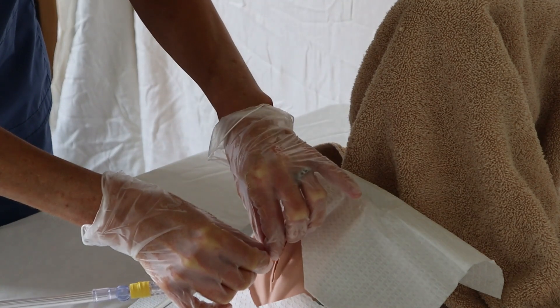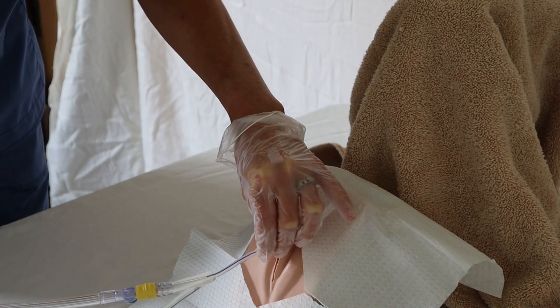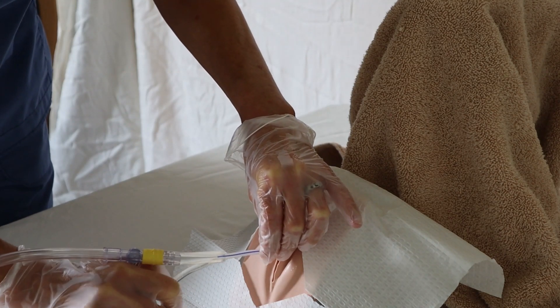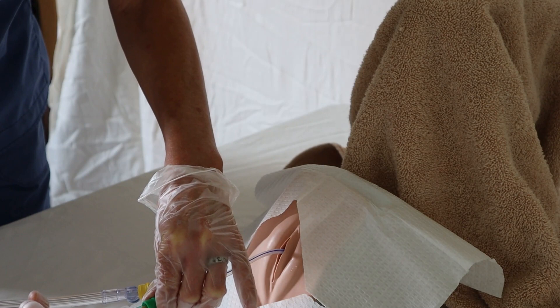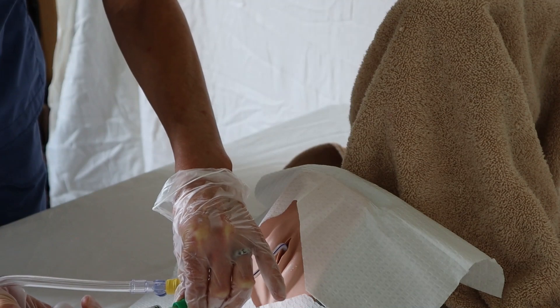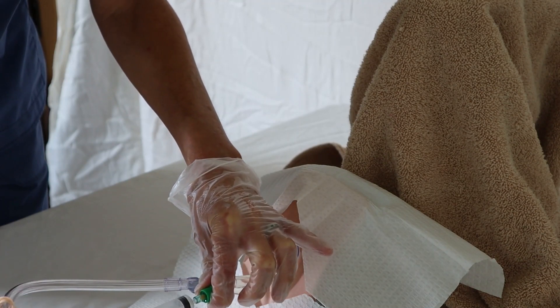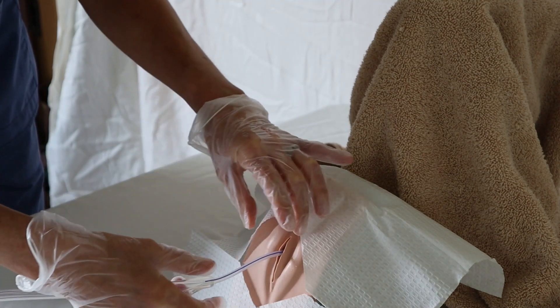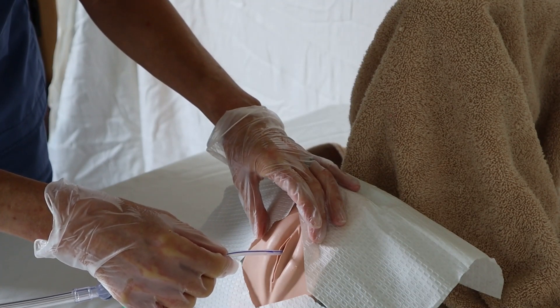I use my left hand to stabilize the catheter, then use the syringe port and inflate the balloon with the full 10cc. Make sure that you hold the plunger down as the syringe empties. If you let go of the plunger, it will deflate automatically. Hold the plunger down, then disconnect.